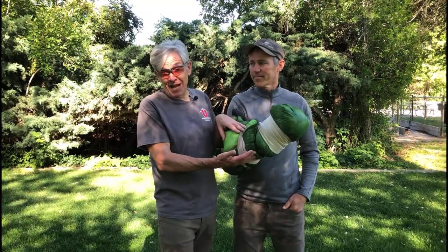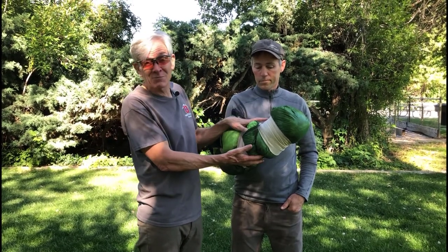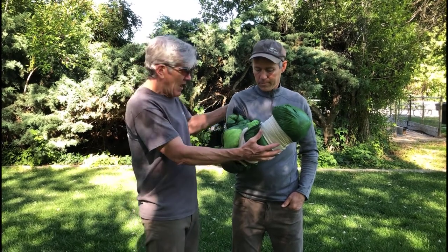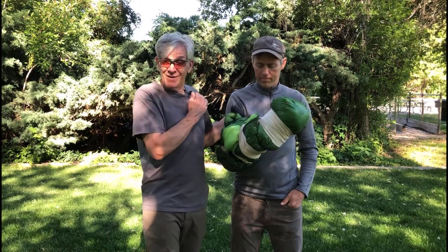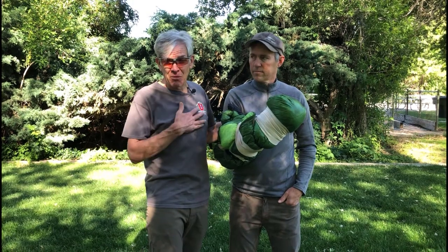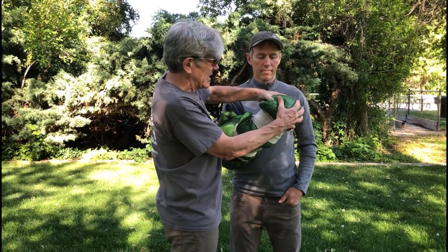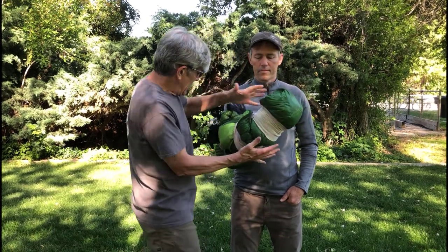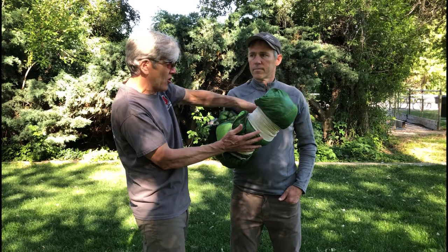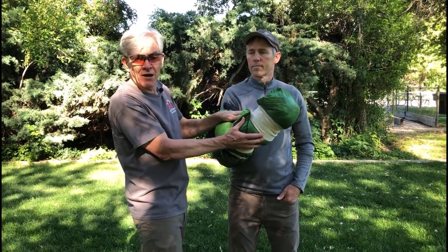Here's an example of what not to do. The most notable problem is there's too much padding — that's bulk. We try to fill voids but avoid excessive bulk. All of this bulk prevents the arm from going into the pledge-of-allegiance position we want, and prevents it from gaining stability by using the body for rigidity. This also doesn't allow any CSM access. Even a very small sleeping bag, if applied appropriately with minimal padding between the arm and body, could be used to splint — provided we also allowed CSM access.